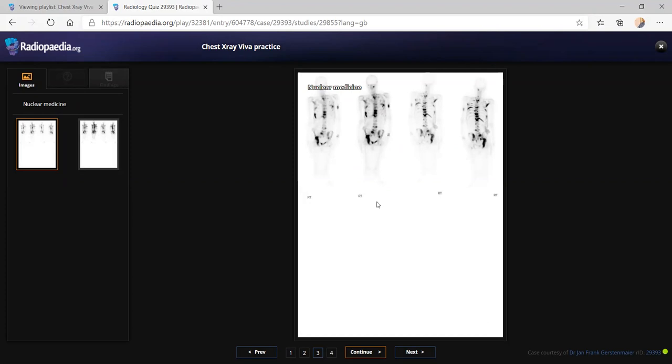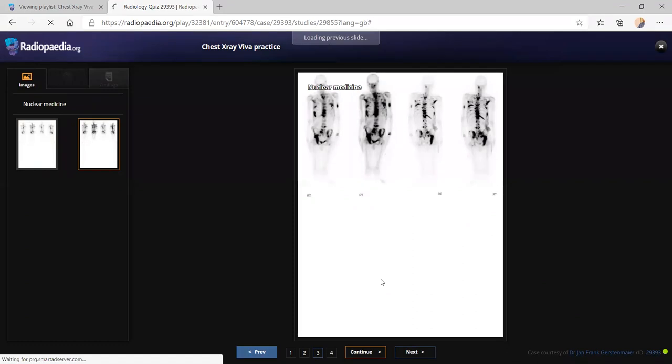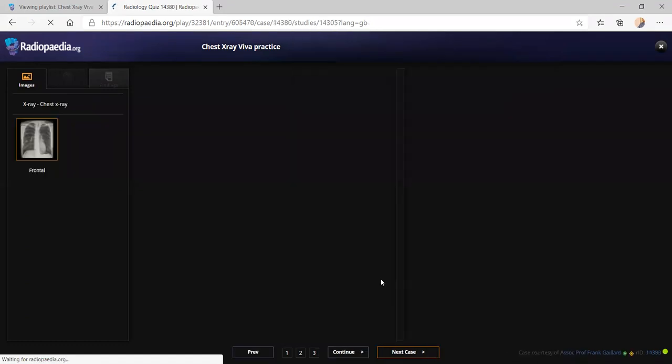Apart from the bone scan, you are not seeing the renal and the bladder shadow. I think this is an injection site, it may not be a lesion. But you are describing it as a lesion. Mostly it will be an injection site. Then you have to refer it to the MDT and evaluate further.